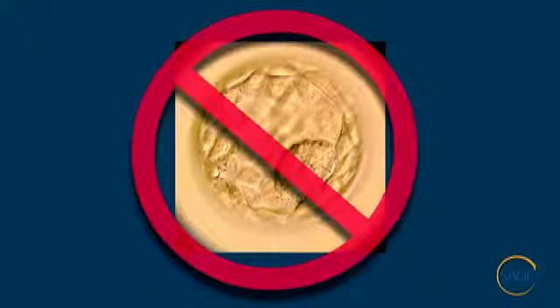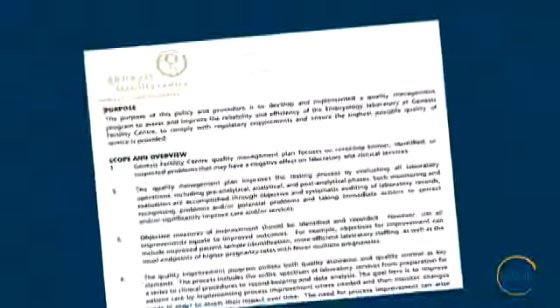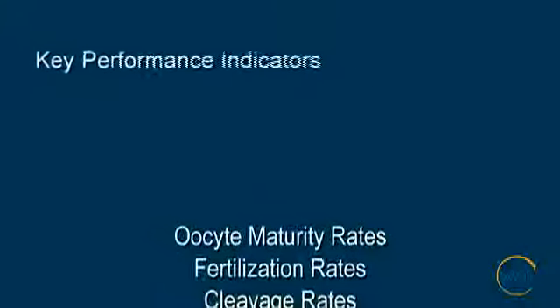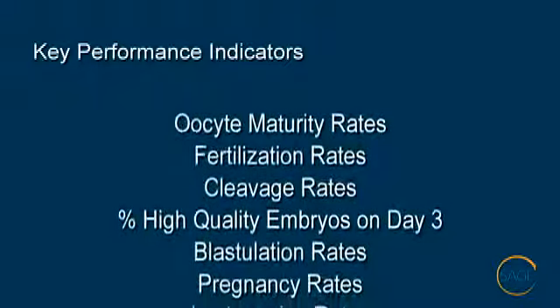How can the IVF laboratory avoid no or poor quality blastocysts for transfer? The laboratory should have in place functional quality assurance and improvement programs that enable the monitoring of key laboratory performance indicators. The laboratory must be able to detect laboratory variations beyond usual and accepted before the results manifest into a less than desirable clinical outcome. The laboratory should be proactive instead of reactive. Attention to fine detail and monitoring relevant laboratory indicators will assist the laboratory in maintaining high blastocyst production rates.